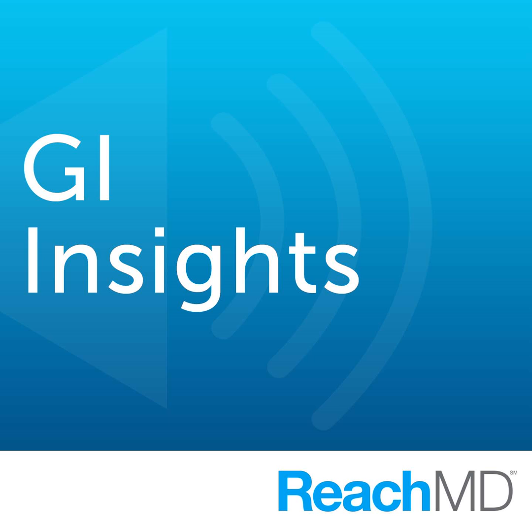As many of us involved in evaluating the small bowel know, video capsule endoscopy remains the first-line diagnostic tool for evaluating the small bowel in obscure bleeding. It's non-invasive, it's easy to perform, it has a relatively high yield of 50 to 60%, and it helps, even in the era of deep enteroscopy, point the endoscopist where to look for a lesion in the proximal small bowel, the distal small bowel, or if there's no lesion, and then maybe the patient should just be treated with iron supplementation.